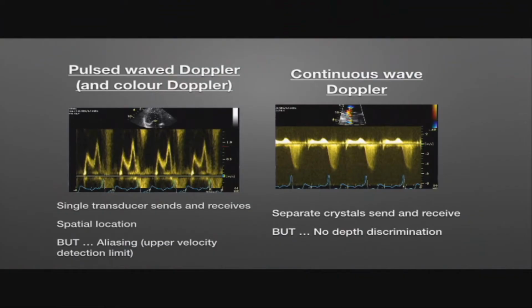And if you're doing some of this vascular ultrasound, you can actually change the gate that you're looking through to try and optimize for some of this. So the more you change the gate, it senses the angle difference that you're looking at, and it accounts for that in the analysis for the movement of the blood. So what does it look like?